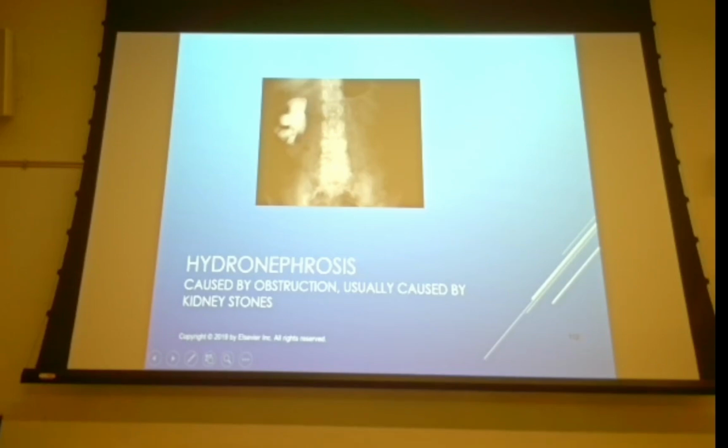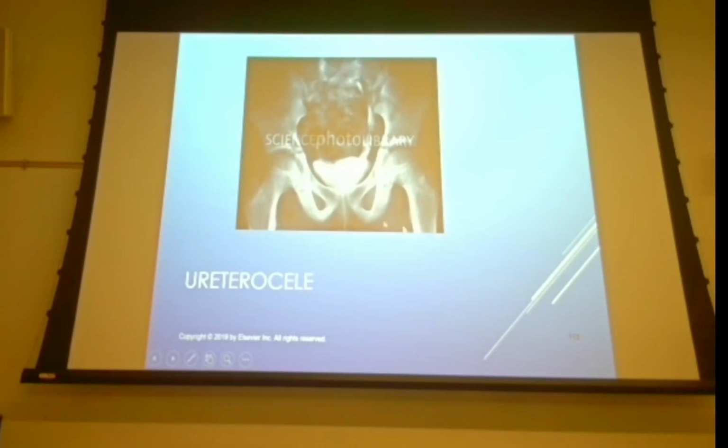Sometimes kids will sit just somewhere perfectly while you're pregnant and mash a ureter so that you get hydronephrosis from it. So it's rare, but once in a while we'll have to do an IVP on a pregnant patient. And in those cases, what we're going to want to do is use higher KVP, lower mAs, save patient dose, possibly shoot PA. Okay, rare, very rare. I think in my entire career, I've only seen one.